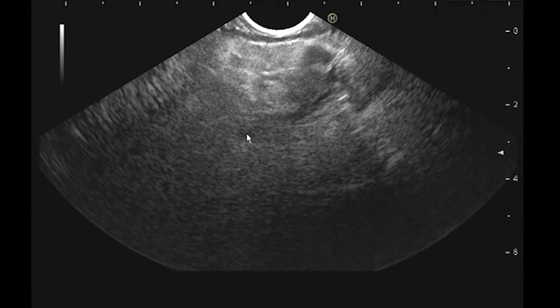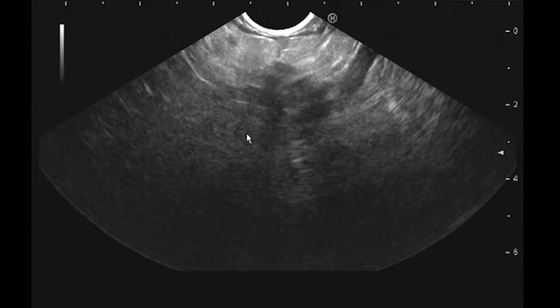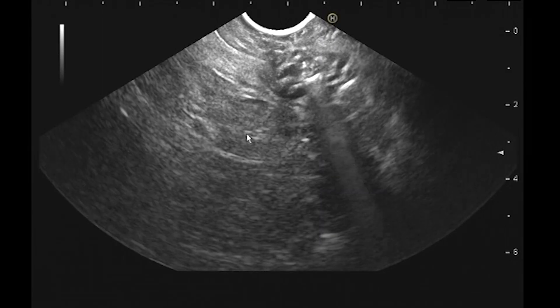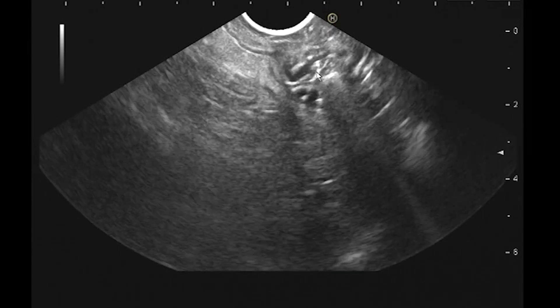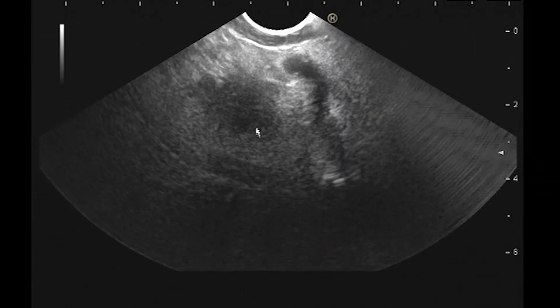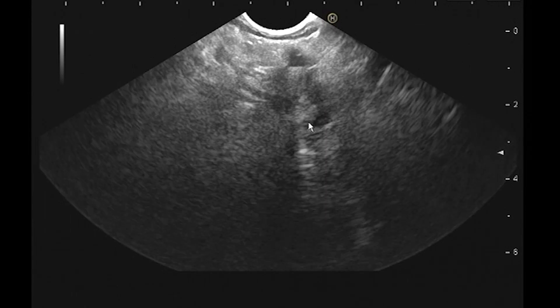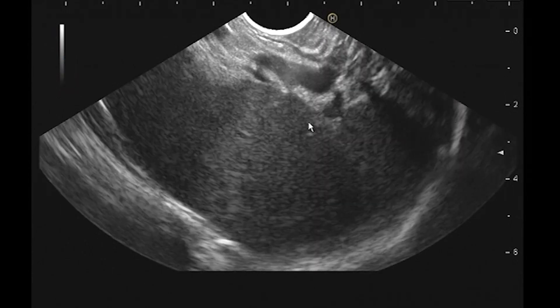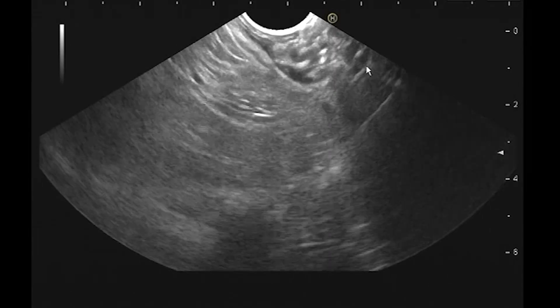I think the splenic vein is encased right there — it's really got the confluence very close to the splenic vein. Does she have gastric varices? Yeah, she's got early gastric varices due to splenic vein involvement. If you follow the liver, you can see the vein coming out. There's the confluence. Here's the splenic vein, which is encased. There's still a little Doppler there. And if you go out to the fundus, you can see there's excess collaterals in the hilum — she's got early gastric varices in the fundus right here.